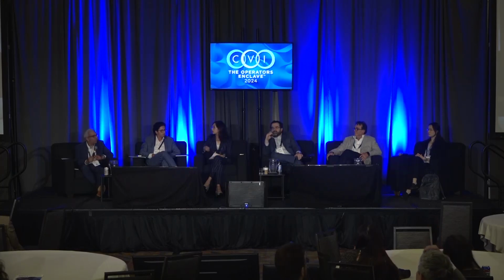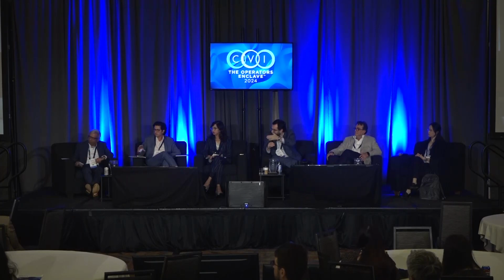Jason, I have a quick question. Is there any type of anatomy that you would consider to be non-suitable for this? So, too shallow perhaps, although it sounds like the minimal depth is 7 or 8, about 9 millimeters. The appendage comes in all sorts of shapes and sizes, but is there something that you found that you shouldn't be using this with? I would say our main limitation at this point is we don't have a super large ball, so we're not treating really large appendages at this point.